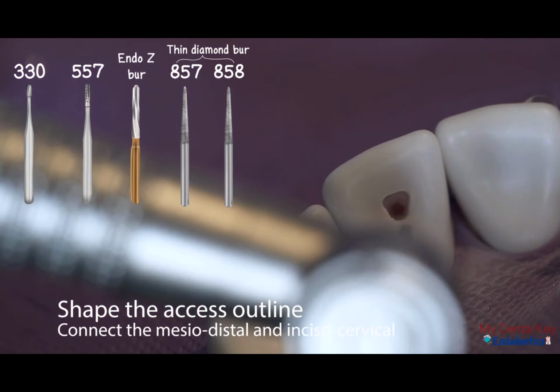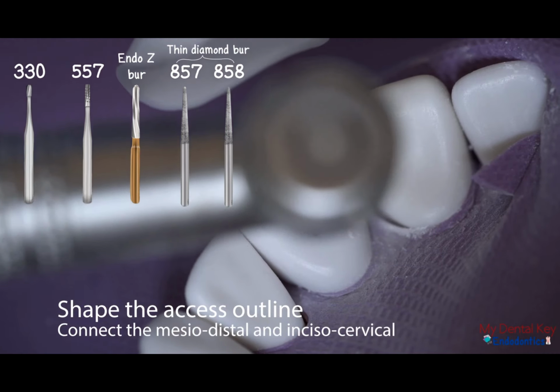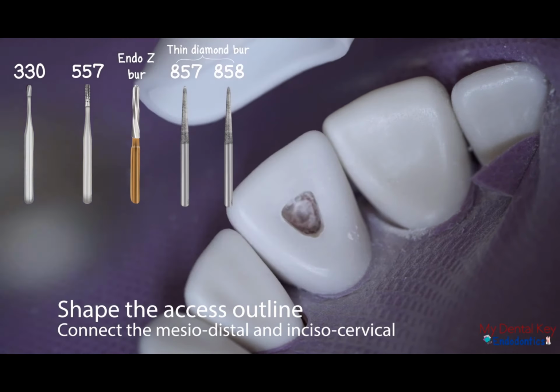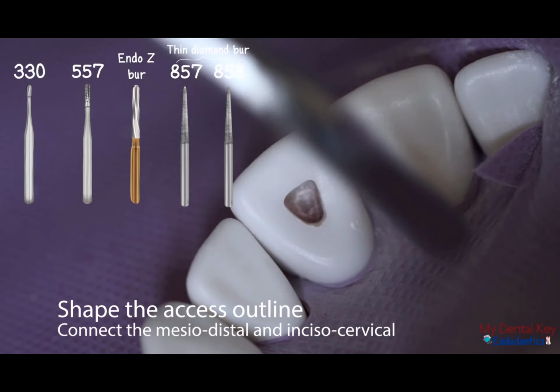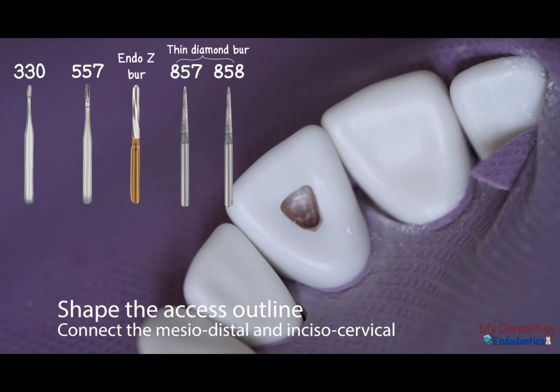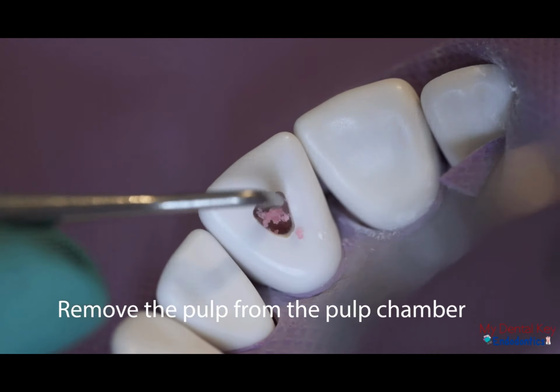Burr options for this step include carbide burrs numbers 330 and 557, the endo Z burr, and an 857 or 858 thin diamond burr. For shaping the access chamber for the CDCa, we like using the 857 or 858 thin diamond burr depending on your comfort level with safe end versus non-safe end burrs. After shaping the access opening, remove the pulp from the pulp chamber using a spoon excavator.